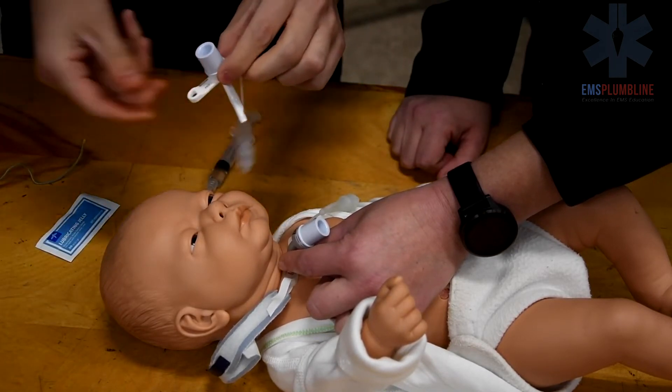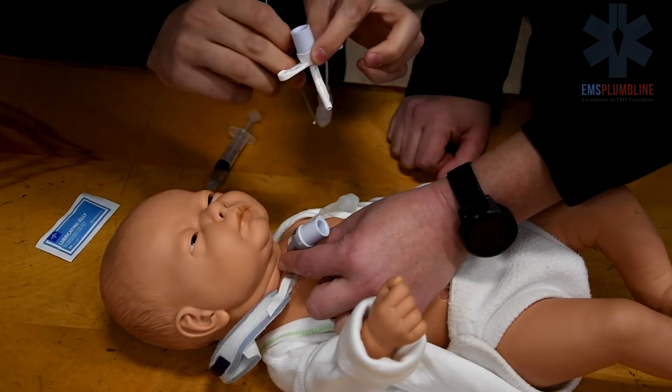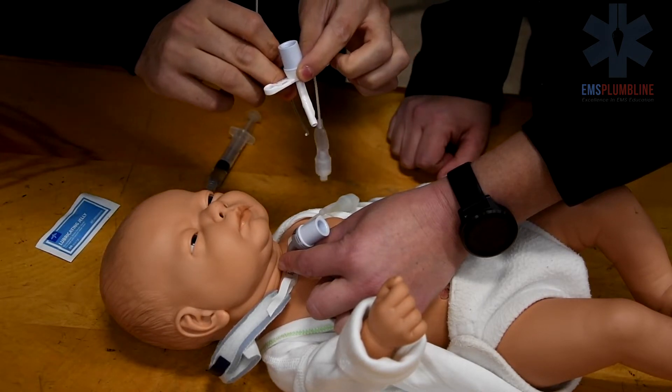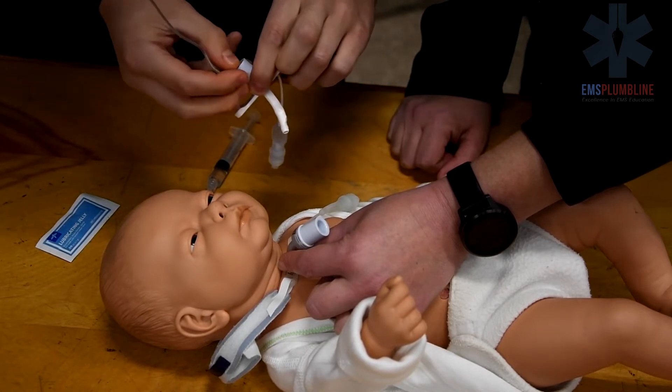To use a stylet as the obturator, insert it into the trach tube until it is flush with the end of the tube. Kink the stylet to prevent it from moving.